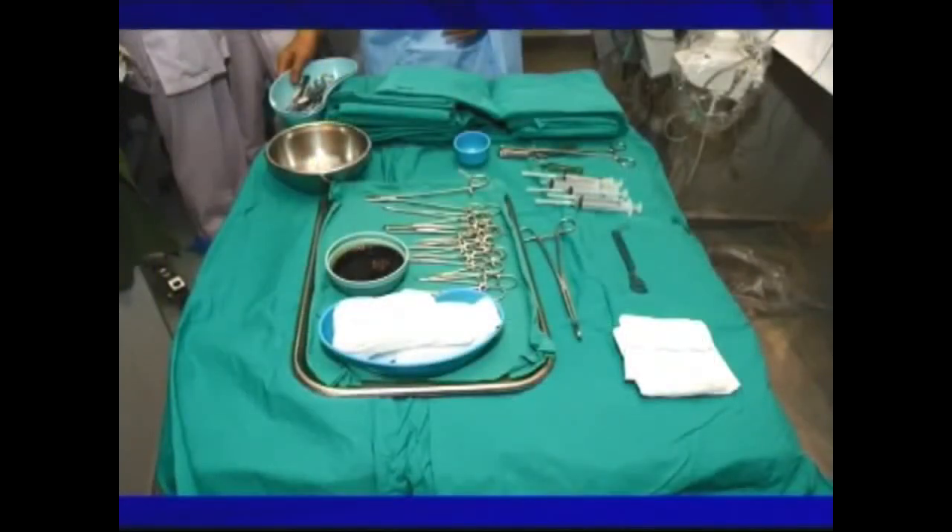This is the surgical trolley for the implantation of a pacemaker. It contains different types of artery scissors and also forceps.